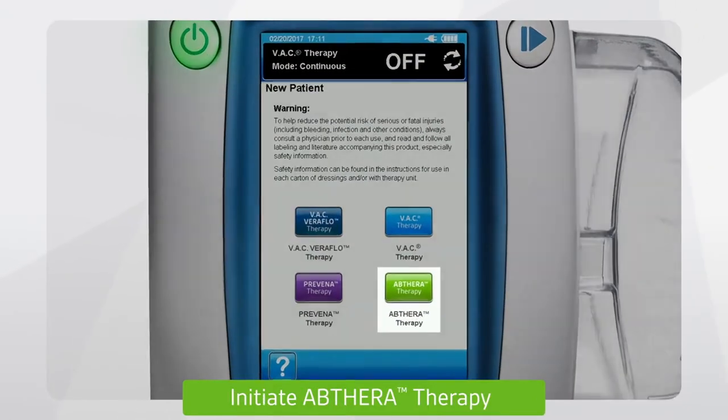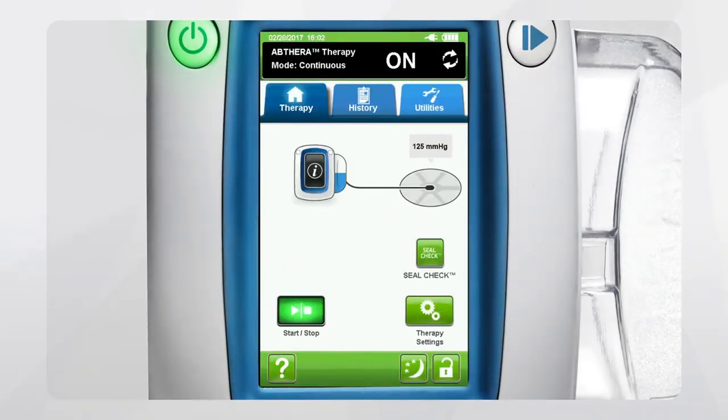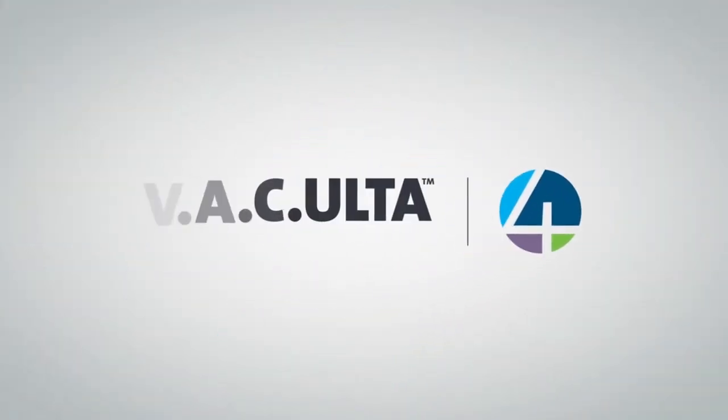To initiate Abthera Therapy, press the green Abthera Therapy button. It's important to note that unlike other therapies, an Abthera Leak Alert will not turn off the VAC Alta Therapy Unit. If the alert sounds, the unit will continue to apply negative pressure.